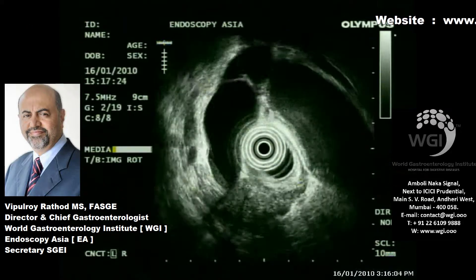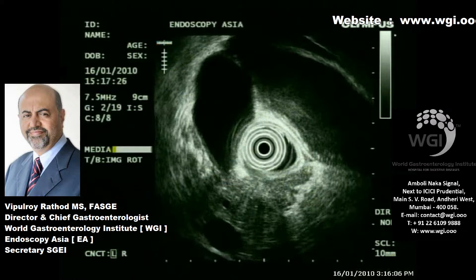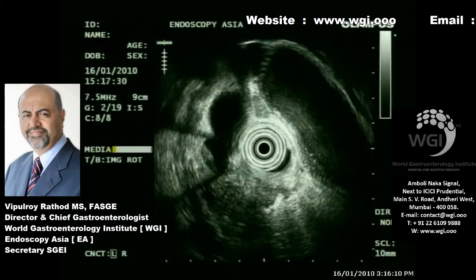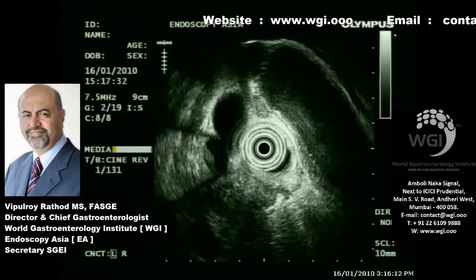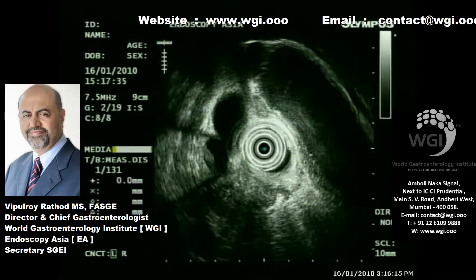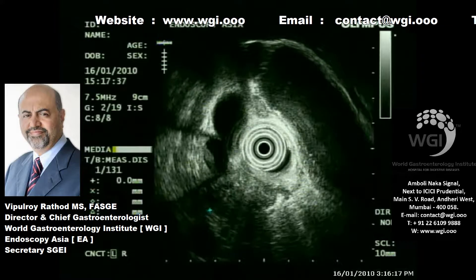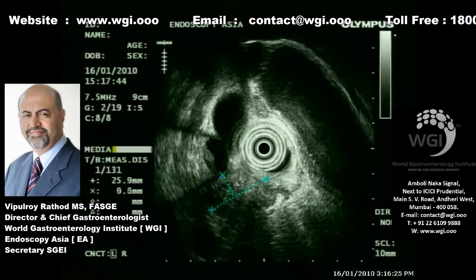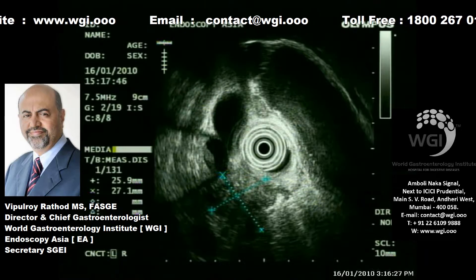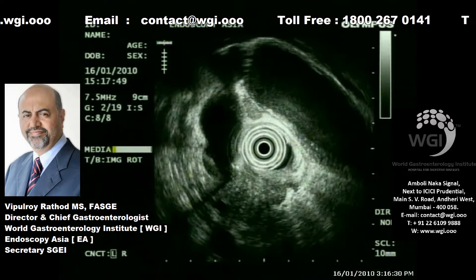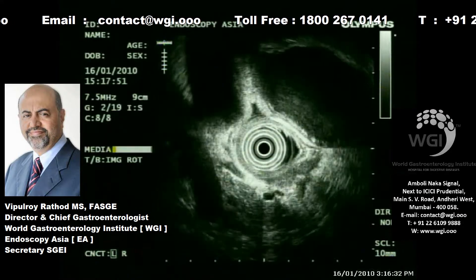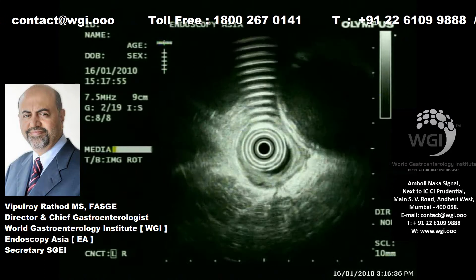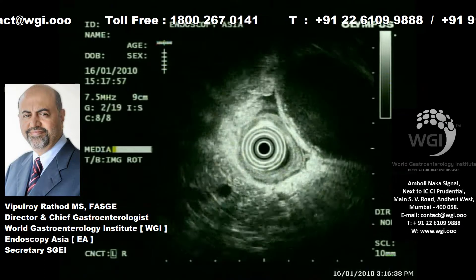However, minimal free fluid was seen in the pericholecystic area, and there were a few lymph nodes noted as well. You can see the lesion very well now, and its dimensions are somewhere around 2.5 centimeters by 2.8 centimeters. It is our experience that any tumor beyond 2.5 centimeters — you can also see the dilated pancreatic duct here.